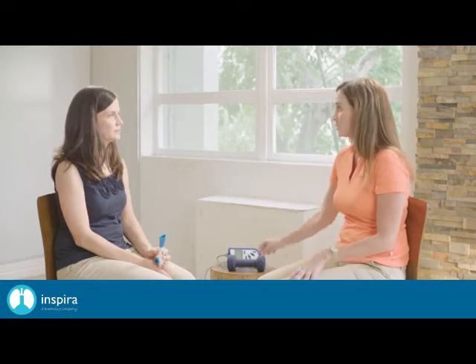Okay, I'm going to check your breath support while talking now. I want you to count out loud to 15. I'm going to tap my pen, and I just want you to count and keep up with my pen. Whenever you're ready. 1, 2, 3, 4, 5, 6, 7, great. 8, 9, 10, 11, 12, 13, 14, 15. Okay, good. So you only had to stop one time to take a breath. So that means you're level 1 on the VRI.